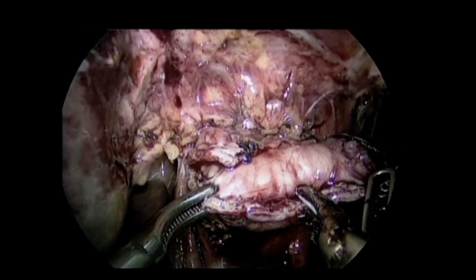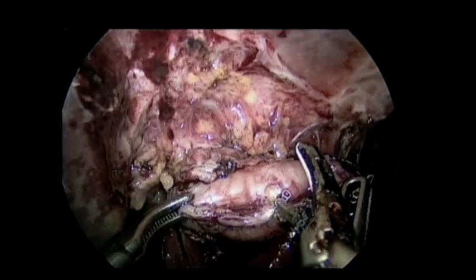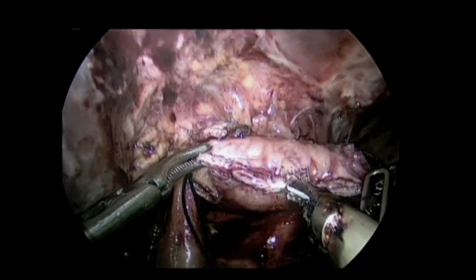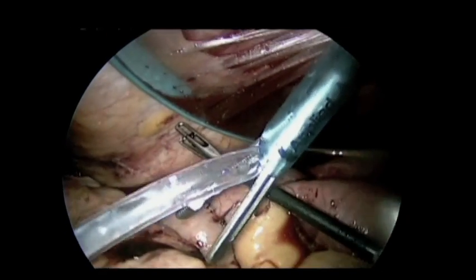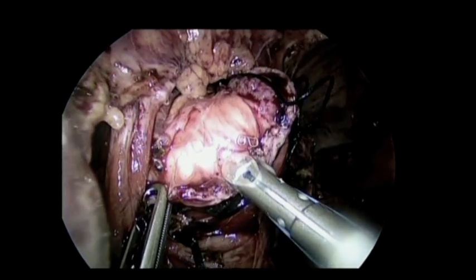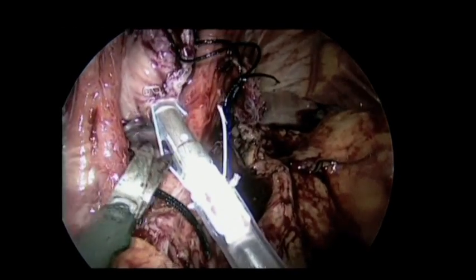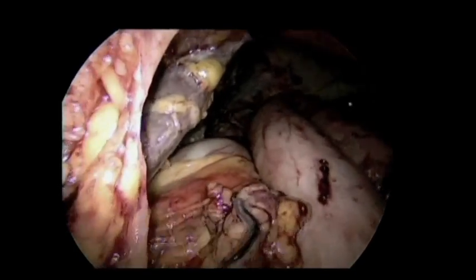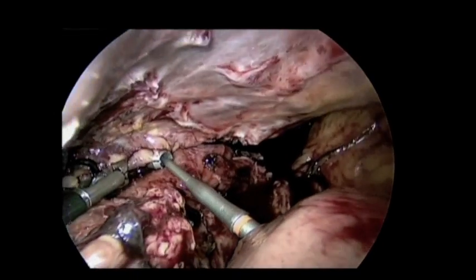We then proceeded with reestablishing gastrointestinal continuity. We used a 25-millimeter circular stapler with the OrVil technique. We performed our gastrostomy here. The OrVil was then introduced through the NG tube, the sutures were cut, and the NG tube was separated from the OrVil. The stapler handle was introduced through the abdominal wall using the wound protector into the Roux limb. You can see the candy cane coming up, and the spike is introduced through the jejunal wall, then aligned with the OrVil.